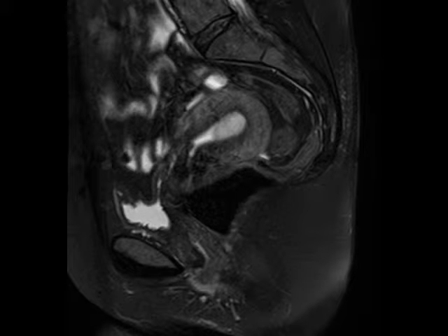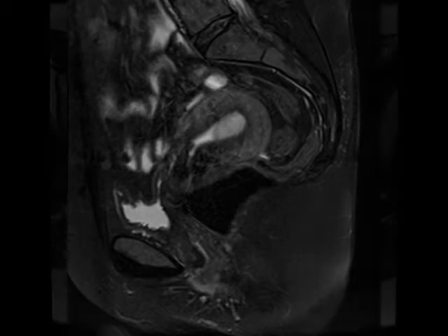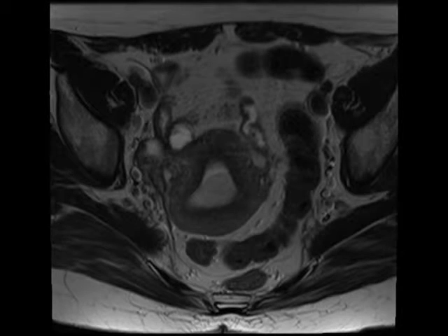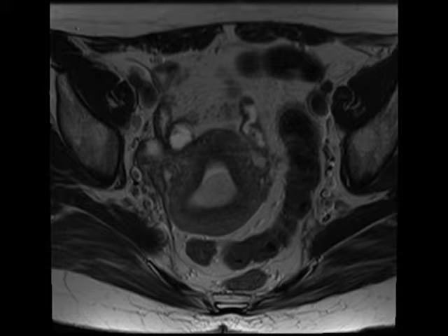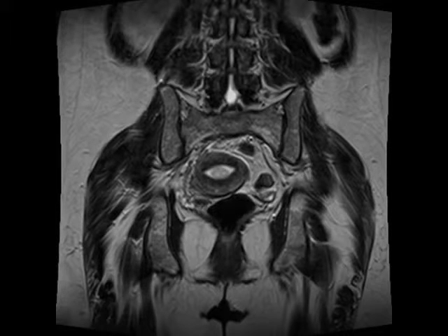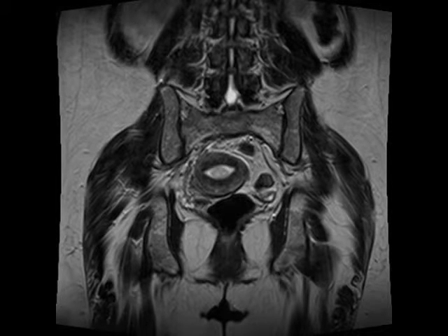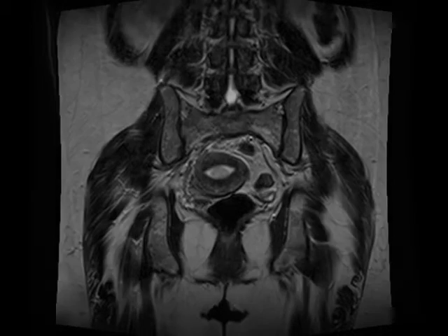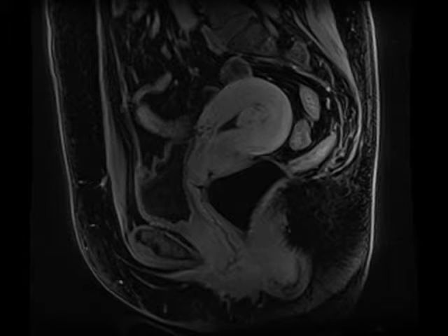Here's a nice example of an endometrial polyp on MRI. On the T2-weighted images you can see there is clearly distension of the endometrium, particularly near the fundus, and there appears to be a discrete T2 hyperintense mass that demonstrates somewhat heterogeneous but still relatively avid enhancement on the post-contrast images.